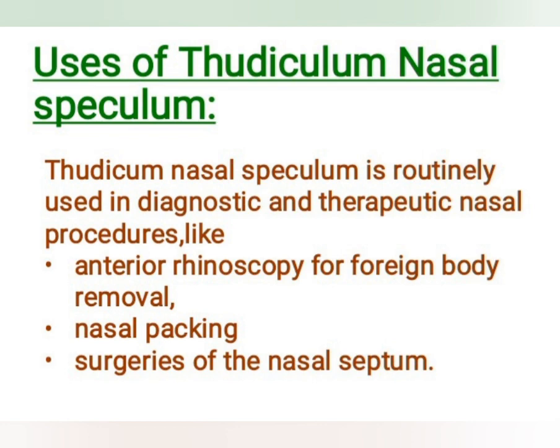Let's see the uses of Thudicum nasal speculum. It is routinely used in diagnostic and therapeutic nasal procedures like anterior rhinoscopy. Rhinoscopy means visualization of the nasal cavity, for foreign body removal, then nasal packing and surgeries of the nasal septum.